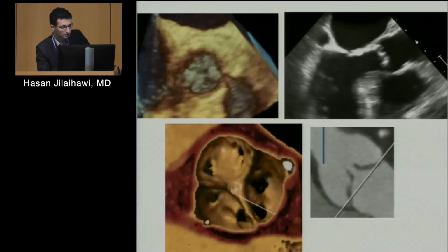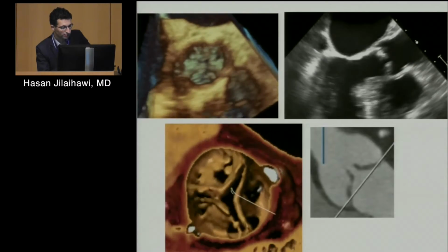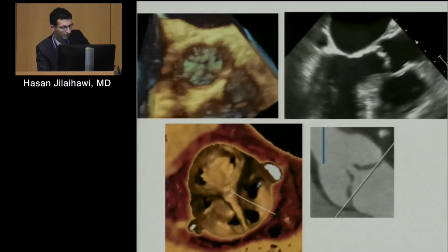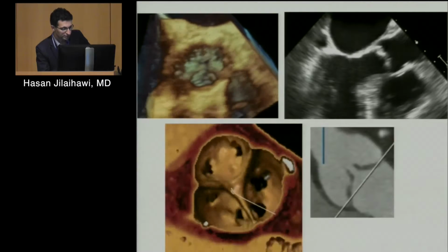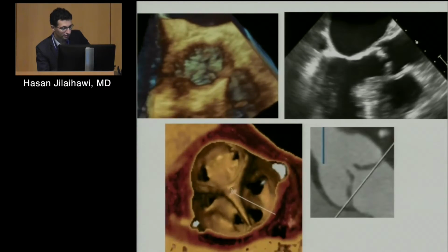And again, in this case, the report said severe valvular calcification, and you see almost no calcification on the 4D CT, and very clear images.